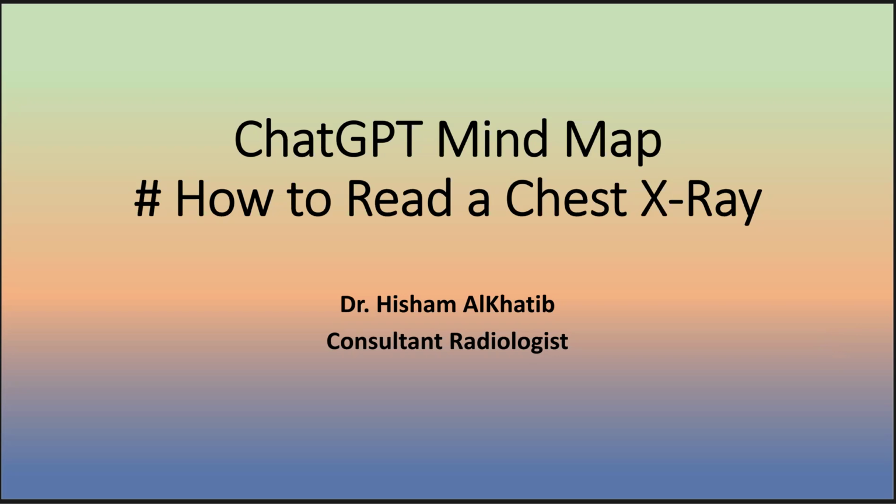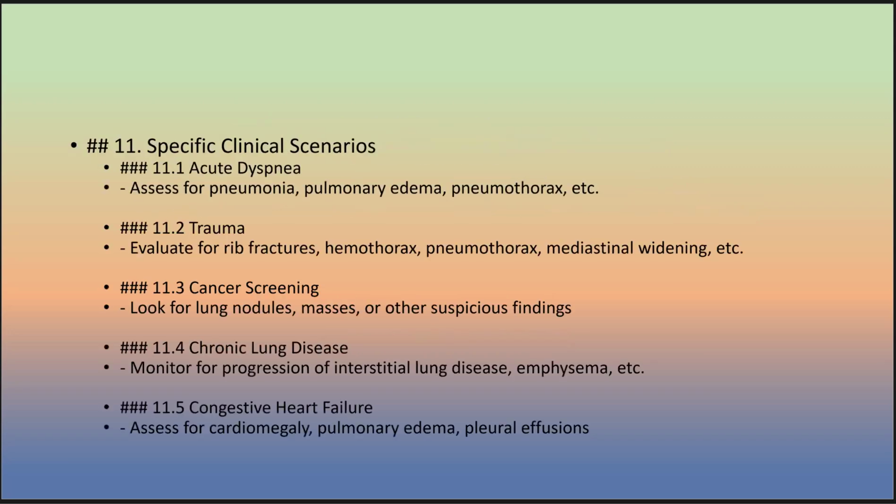This is a continuation of ChatGPT involving radiology training, and we are continuing in this short tutorial how ChatGPT is used to evaluate the chest X-ray in part 2. We asked ChatGPT for more information about reading the chest X-ray. Number 11, it gave us specific clinical scenarios.